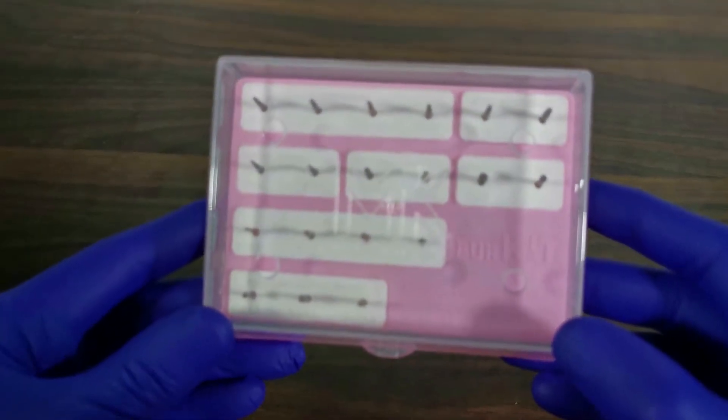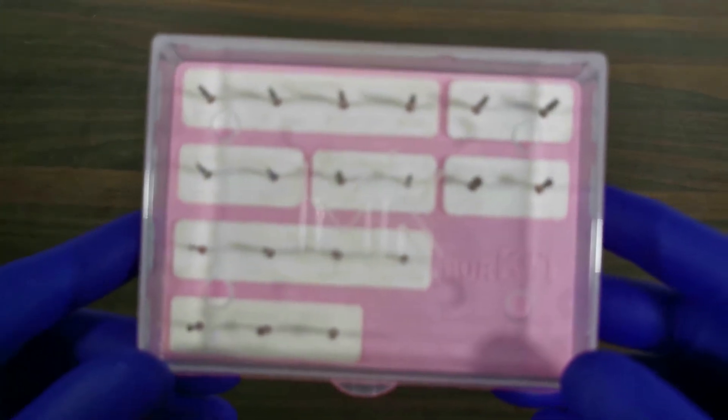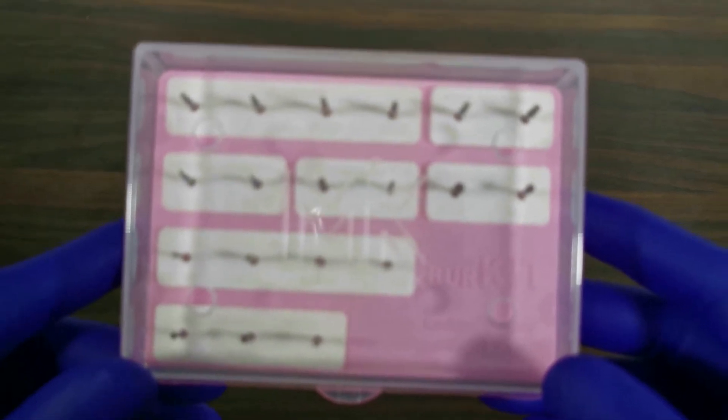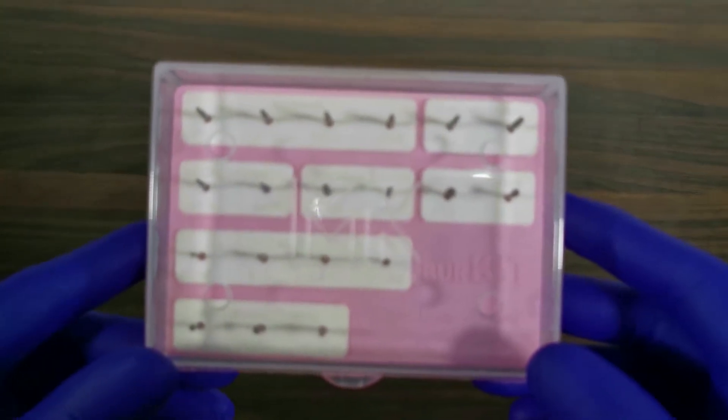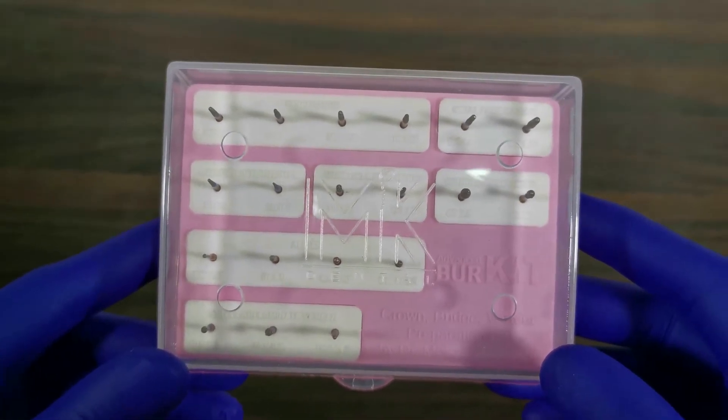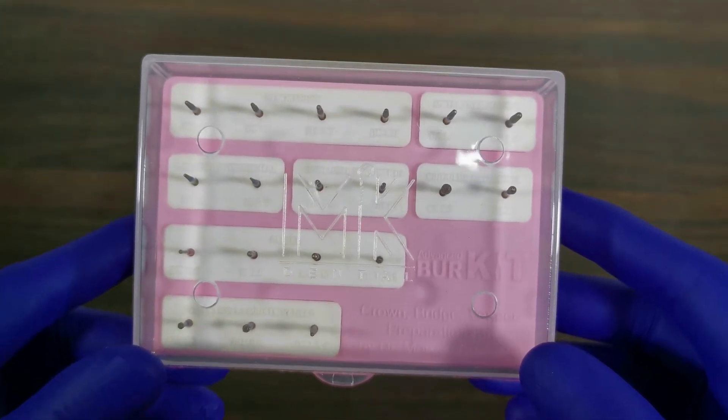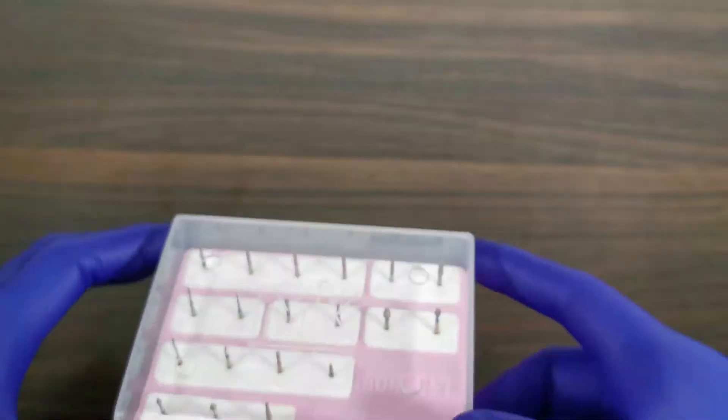For ease of recognition and communication, the burrs are named on the basis of either their tip design, e.g. MS for modified shoulder, DC for deep chamfer, etc., or on the basis of their function, e.g. OR for occlusal reduction, IR for incisal reduction, etc.